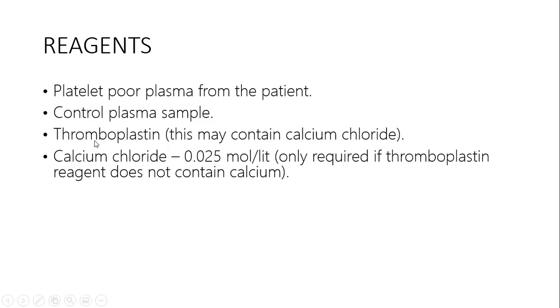But there are already reagents, no, mga thromboplastine reagents that are already incorporated with calcium ions, such in the form of calcium chloride. Pero again, kung wala gani ang reagent nga thromboplastine, kung wala siya gani unod or wala mi naka-incorporate nga calcium sa iya, no, makuha kita additional reagent nga calcium chloride, right, to mix with your thromboplastine.